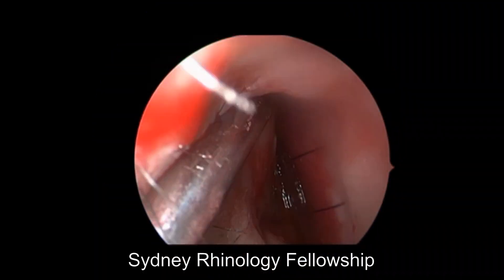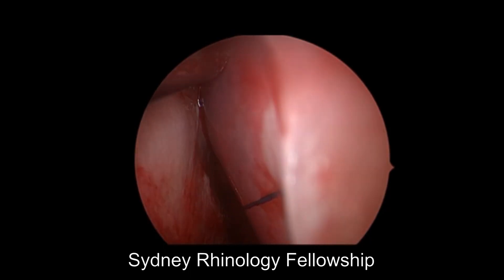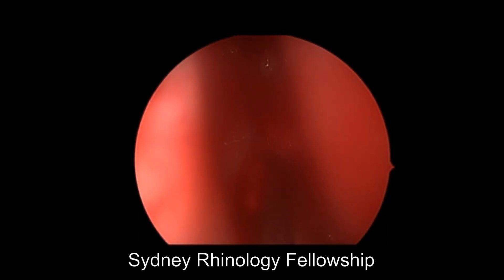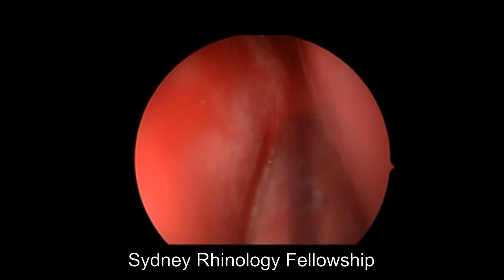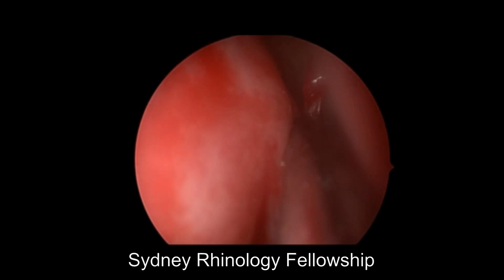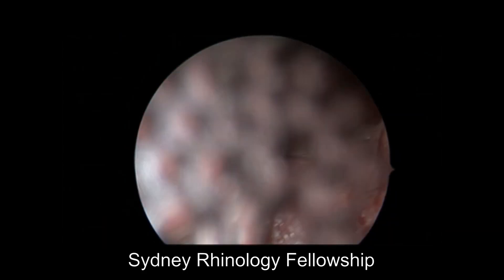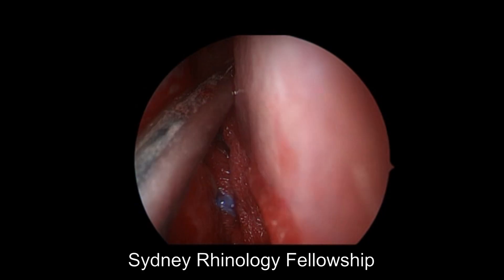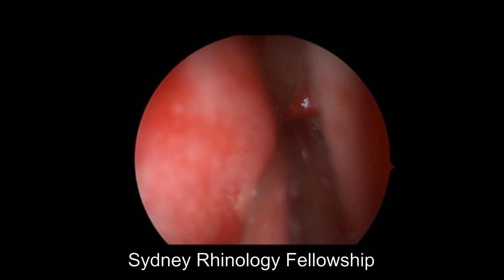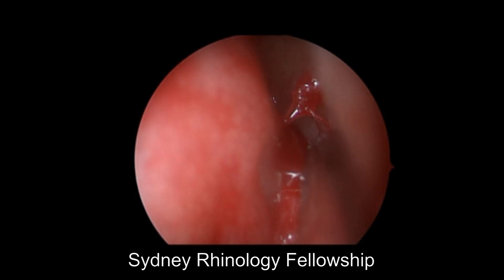Here's another example of someone who'd had recurrent epistaxis, had been packed, had had a sphenopalatine artery ligation, but in fact when the silicone sheets were removed the patient re-bled again. Heading up towards the septum, just at the beginning of the olfactory cleft near the middle turbinate root, you can see a clear telangiectatic vessel bleeding from the septum. This is another great example of the S-point — a telangiectatic vessel coming from the anterethmoidal artery complex.